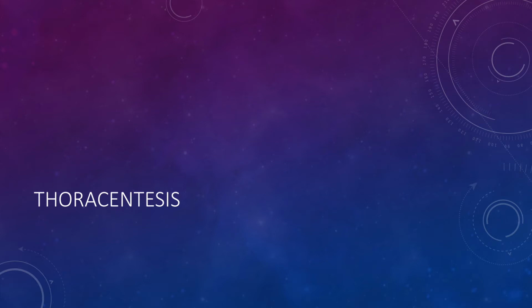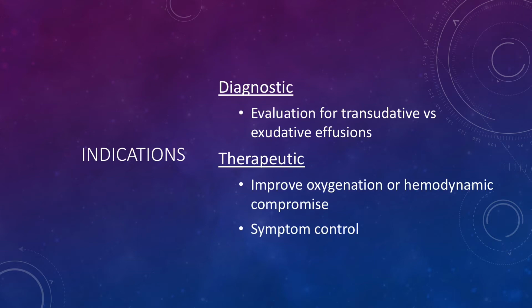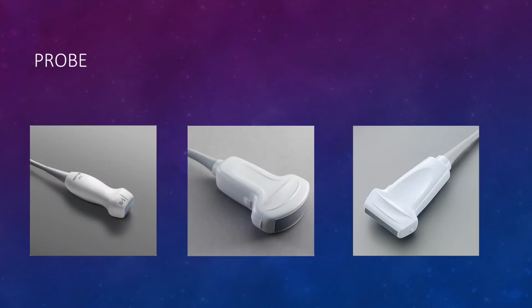So, thoracentesis, let's get into procedures. For thoracentesis, we are going to talk about the diagnostic and therapeutic indications. This procedure is normally done for evaluation of transudative versus exudative pleural effusions. Sometimes in our setting, this can be a therapeutic procedure to improve oxygenation or hemodynamic compromise and help with symptom control. Any of the three probes can be used for this procedure.